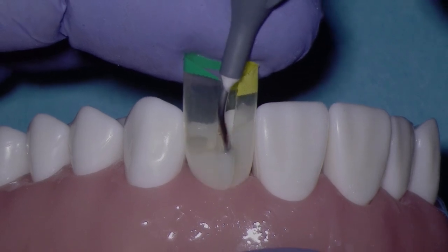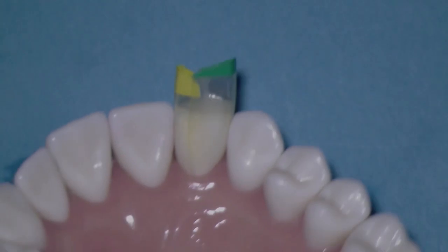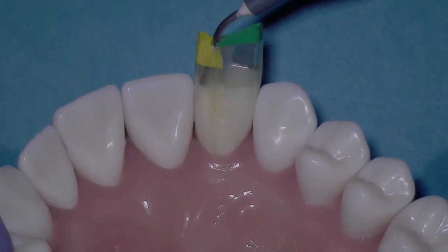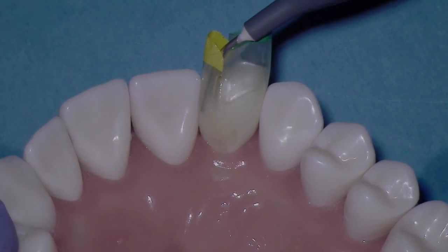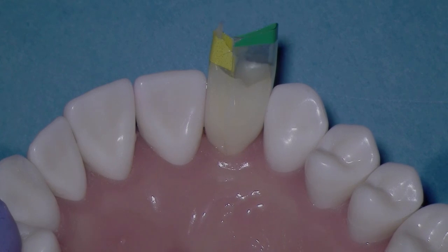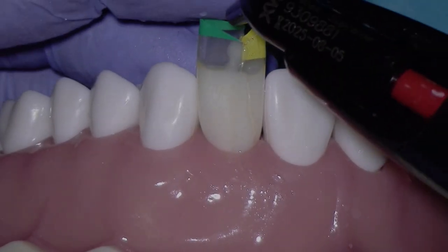Check the lingual. Make sure we're able to get the flowable all the way around to the corner, but we want to make sure and engage the flowable and inject into the flowable that went around the corner from the facial, and then that moves any air bubbles out through the connection between the two matrices. Once again, we have not light cured yet, and now I'm going to come in with the heated paste composite.